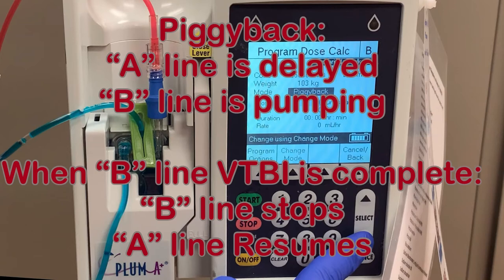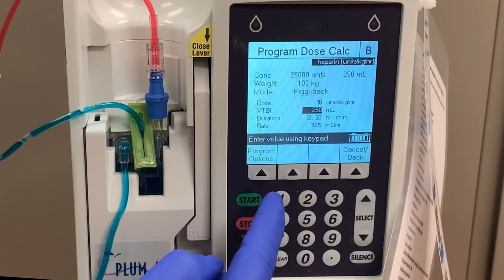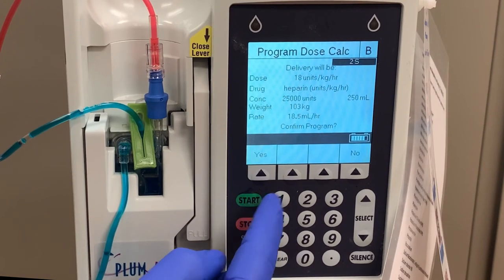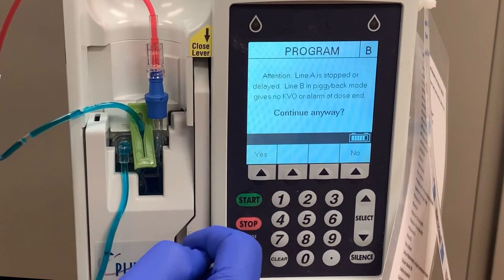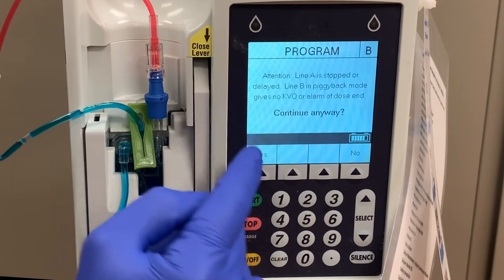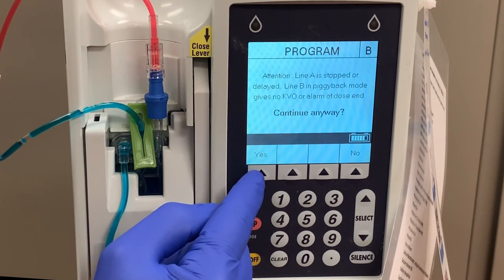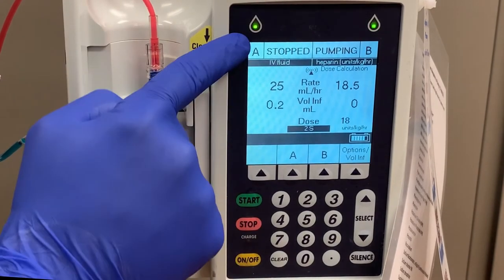There is never an alarm to signify that the B line has completed pumping. Enter the rest of the information as you would with the primary line. When you're ready, press start, and once it's confirmed, press yes. Because piggyback mode requires an A line to be put on delay while the B line runs, if your A line is not currently running, you will get an alert asking if you want to start your B line anyway. Press yes, and when you return to the main screen, press start again, and your A line will be put on delay.